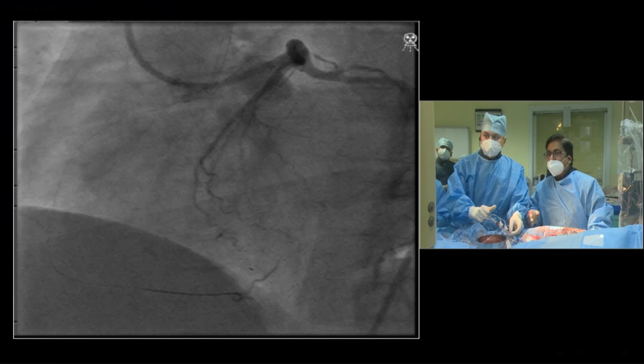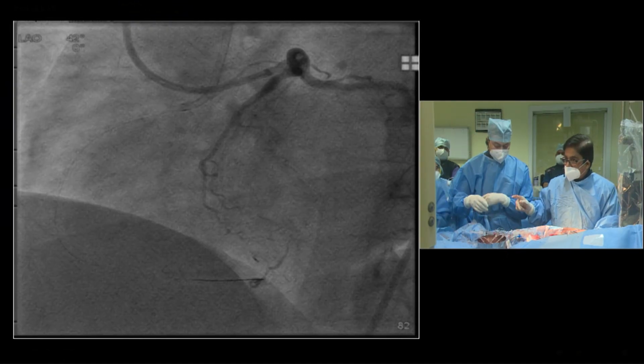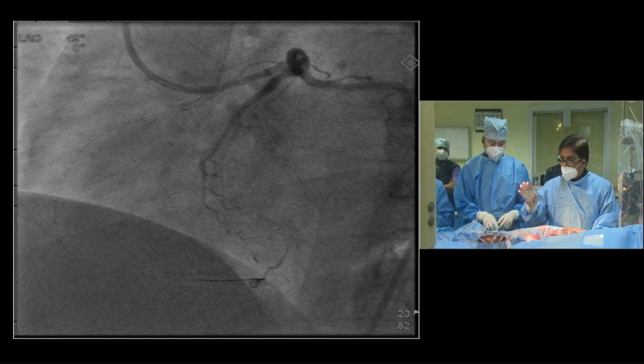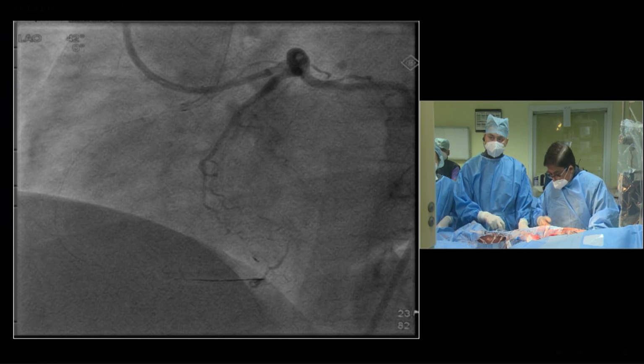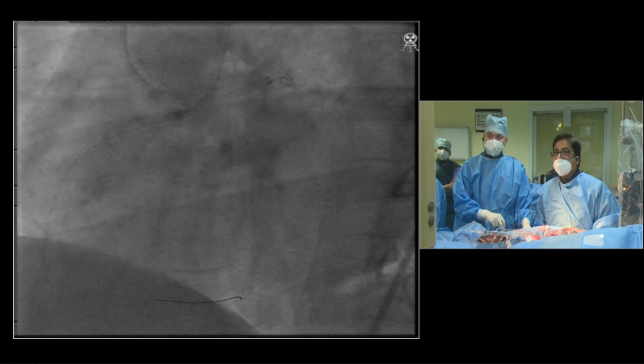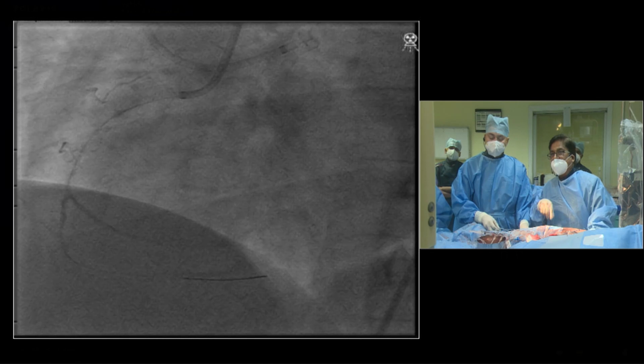Now we need an antigrade. Now we need to inject. I asked him to inject. He injected left. Now left will not work anymore. The left has done its part. Now you have to inject right, because now it is antigrade. So it will not fill through the left anymore. Okay. Come on. Yes. As high as possible. And the frame rate, they have now kept the antigrade inflow is there.